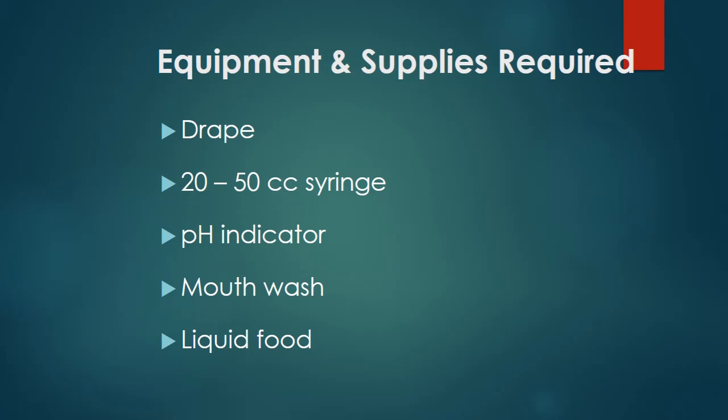Even patients who are fully conscious, but who may be having some issues with their oral cavity so that they must be fed through the NG tube, it is still important to give mouthwash. Allowing the patient to rinse the mouth before commencement of the feeding would stimulate the peristaltic process, that is, the movement of the gut, to allow for easy passage of the food. Then you would need the food that you are going to give, and of course it should be in liquid form. This can take the form of light soup, diluted porridge, even some medications.